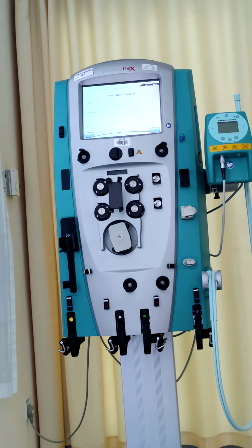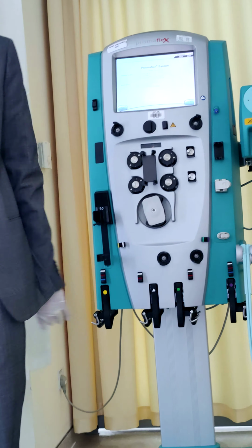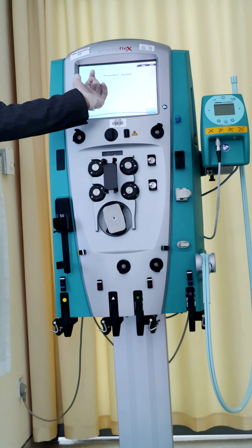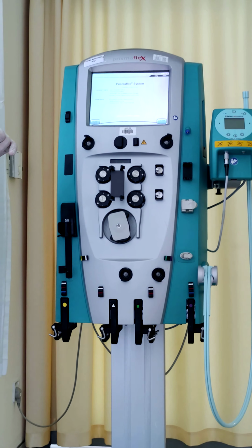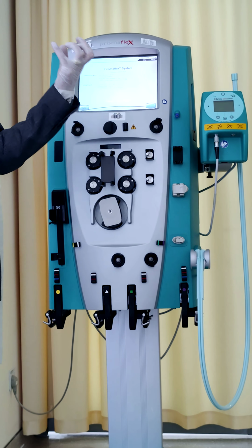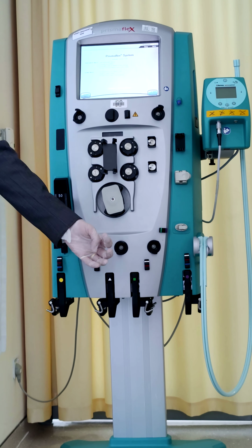For example, we know what is the replacement we are going to do. This you will put in the prescription, the total prescription. But I am discussing now about the bags, the solution. We have to inform the machine the weight of the replacement bag here, which should be the same one that you will hang.